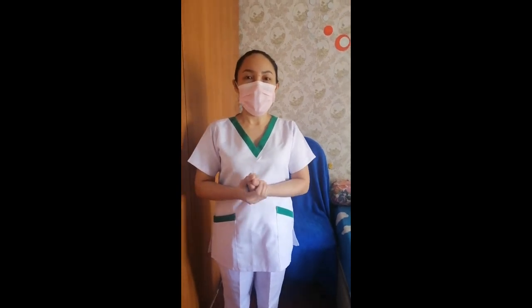Hey guys, I'm Filma Euzon, a trainer from NCMA Nurse Caregiver Management Alliance. For today's video, I'm going to demonstrate how to transfer the patient from bed to wheelchair. So the first thing we want to do is perform hand hygiene.